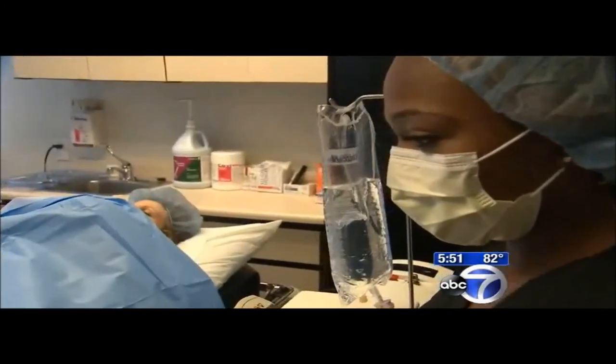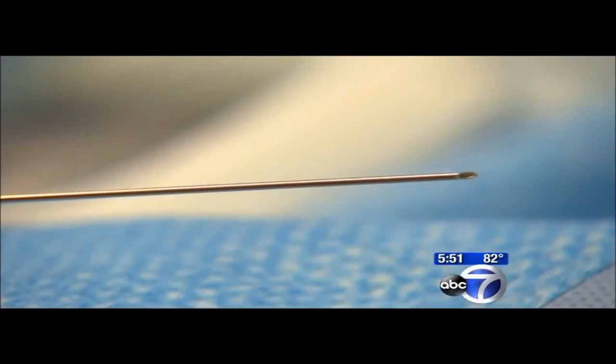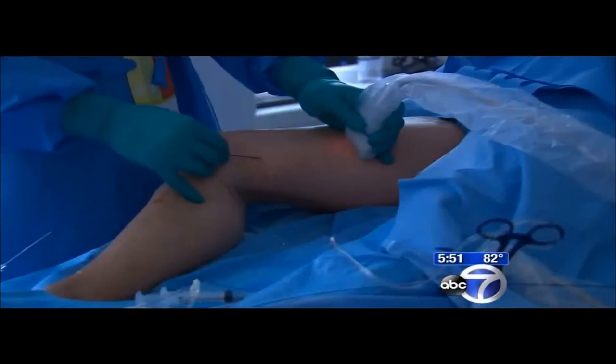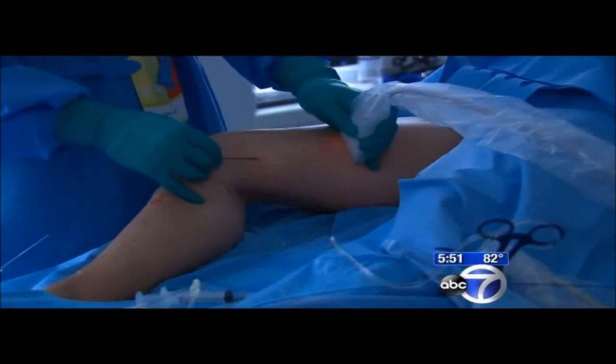The standard sheath can be painful. The skinny needle is no bigger than that used to take a blood sample. The procedure is done only with a little Novocaine anesthesia and some Valium to relax the patient. The laser burns the vein closed and the scar is the size of a pinhead.